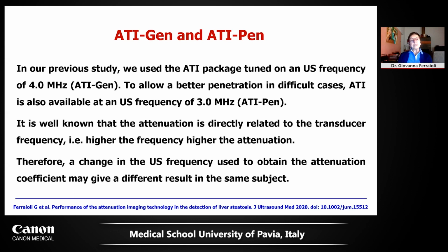In this study, we used the ATI package tuned on an ultrasound frequency of 4 megahertz, what is named the ATI gen. But to allow a better penetration in difficult cases, ATI is also available at an ultrasound frequency of 3 megahertz, the ATI pen.